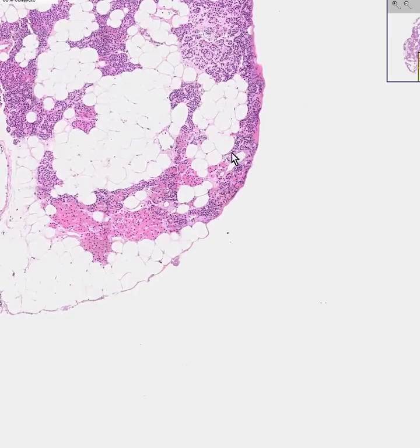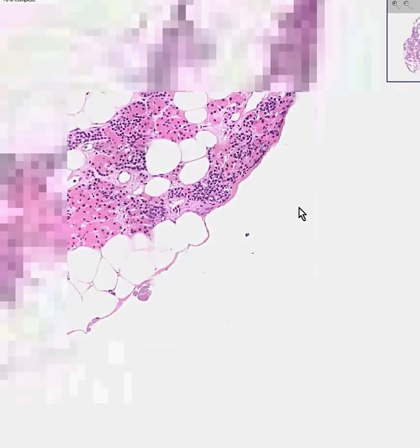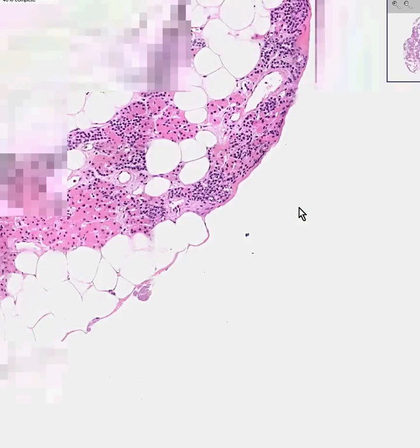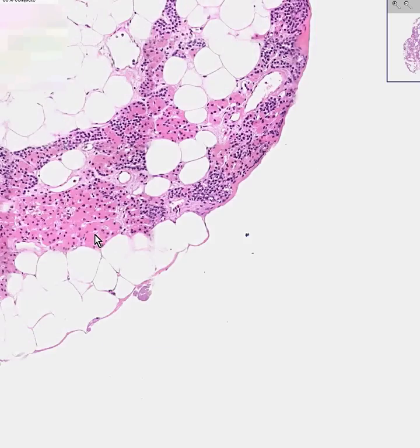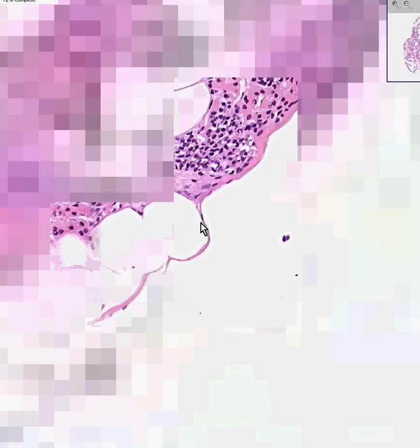Let's zoom in a couple more pops. We'll see that clearly the oxyphil cells stand out like a sore thumb because they are very red. They have a lot more cytoplasm, and otherwise the nuclei of the oxyphil cells look a lot like the nuclei of the chief cells.